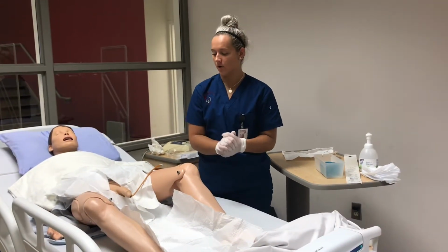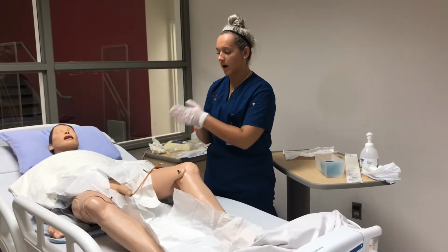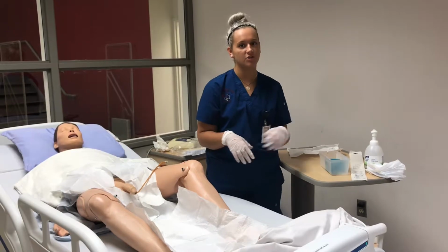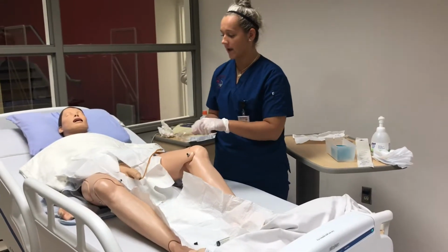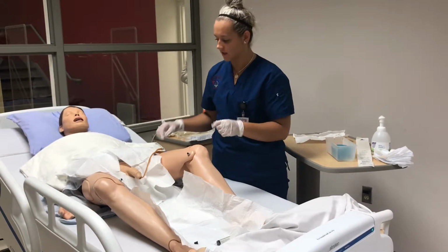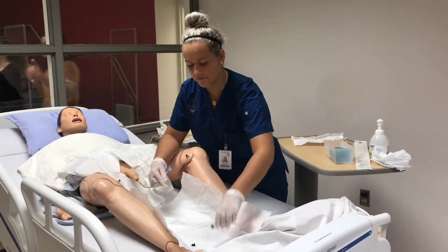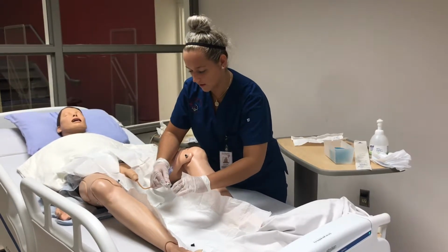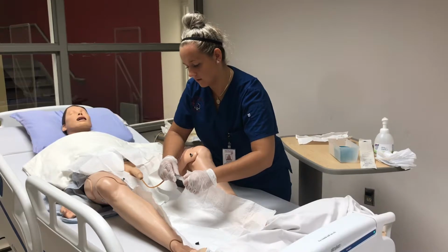Okay, so now I'm going to be discontinuing the Foley catheter. Prior to this, I performed hand hygiene and put on a new pair of gloves. Now I'm going to start by deflating the balloon. To do this, I'm going to have to insert the syringe in here and slowly drain.